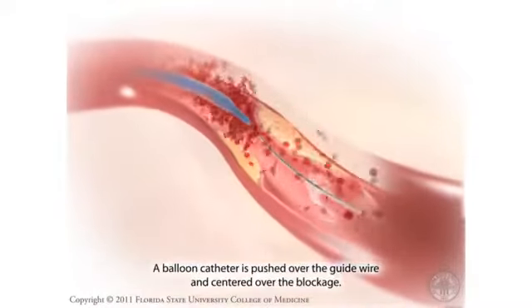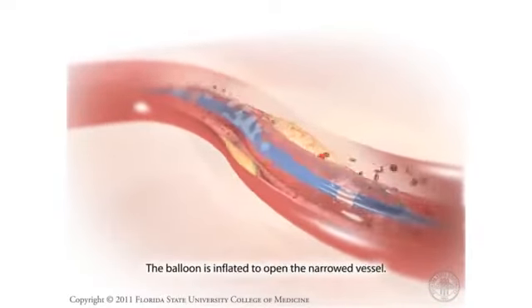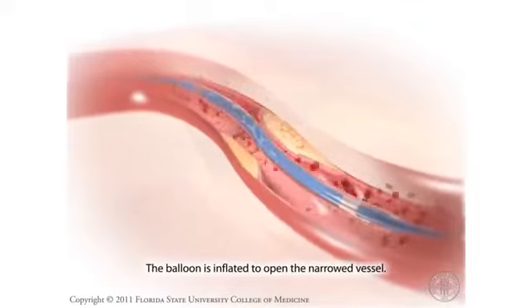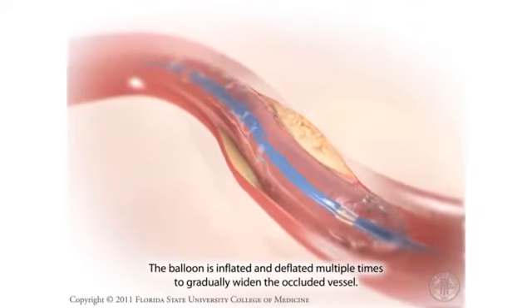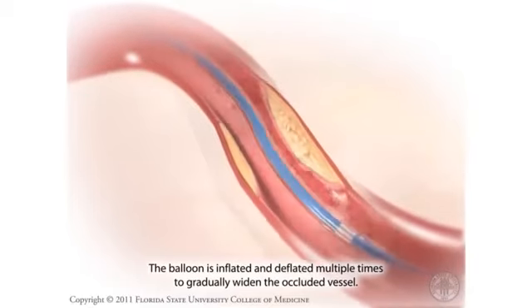A balloon catheter is pushed over the guide wire and centered over the blockage. The balloon is inflated to open the narrowed vessel. The balloon is inflated and deflated multiple times to gradually widen the occluded vessel.